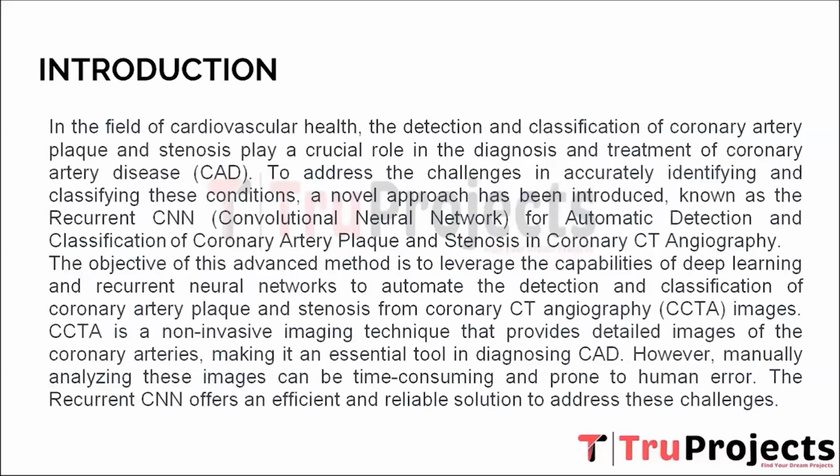CCTA is a non-invasive imaging technique that provides detailed images of the coronary arteries, making it an essential tool in diagnosing CAD. However, manually analyzing these images can be time-consuming and prone to human error. The recurrent CNN offers an efficient and reliable solution to address these challenges.